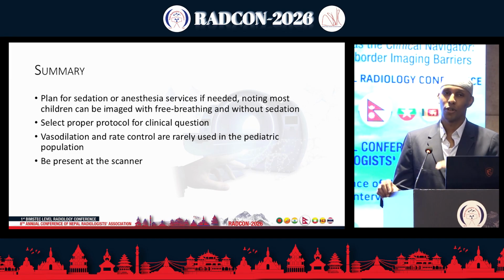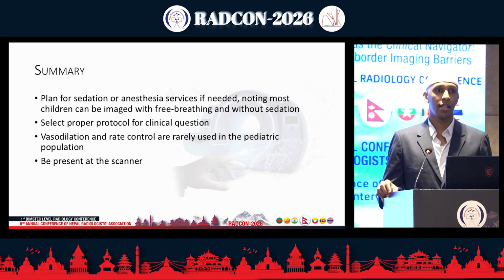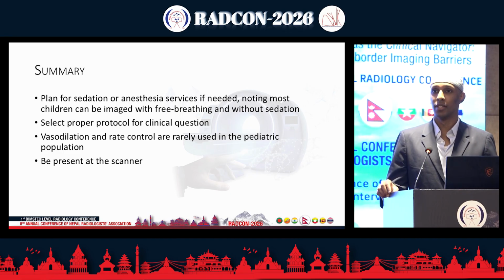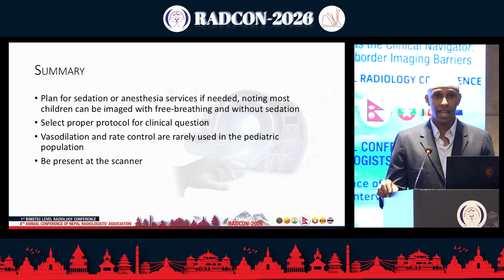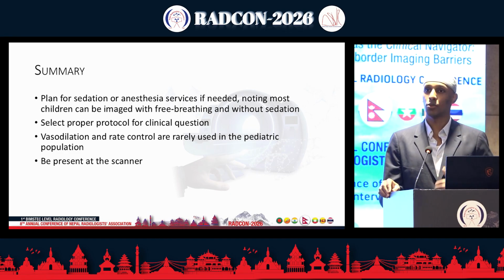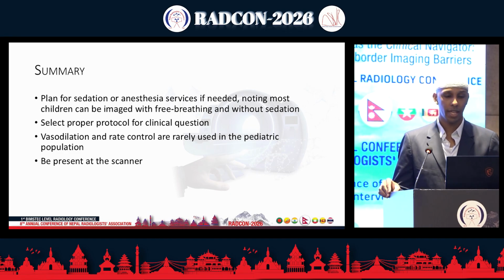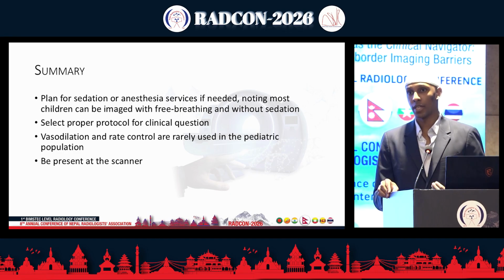And finally, for all cardiac imaging at our institution, the radiologist has to be present at the scanner because you cannot ask a technologist to do this level of protocoling, right? That is not in their expertise. And so you being present at the scanner, looking at the parameters, changing your RR interval, reducing the kVp if you need it to improve your contrast bolus opacification. And finally, to review the images at the close of examination.